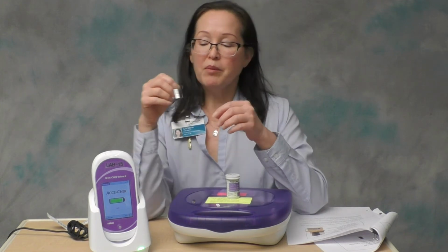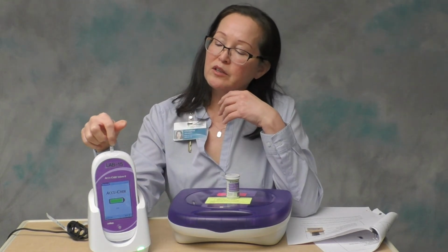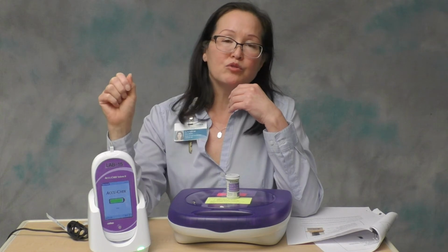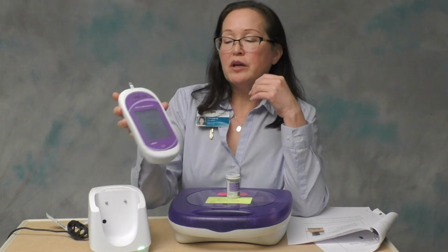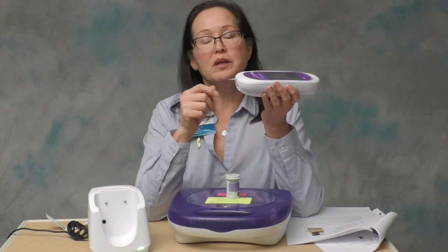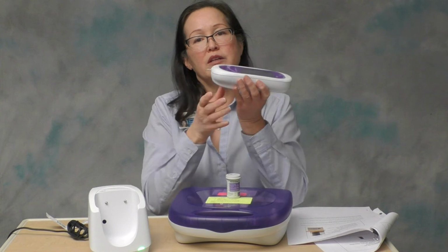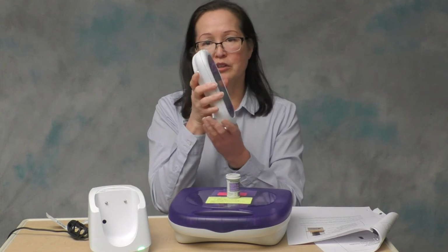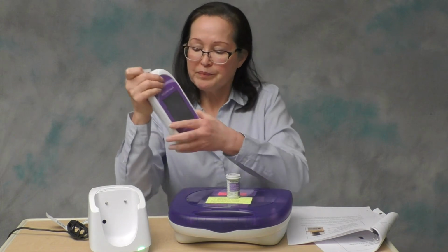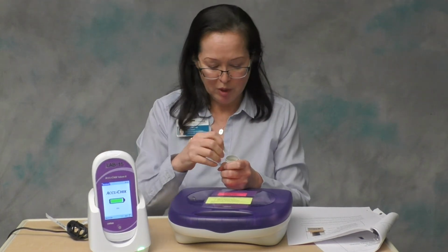The gold chip and the black arrows go into the meter, and then that gray square with the yellow rectangle is where you dose it. I always recommend anytime you have a strip in the meter, keep the meter horizontal. That reduces the likelihood that you might contaminate the test strip port if you hold it vertically or even diagonally. So that's what the strips look like.